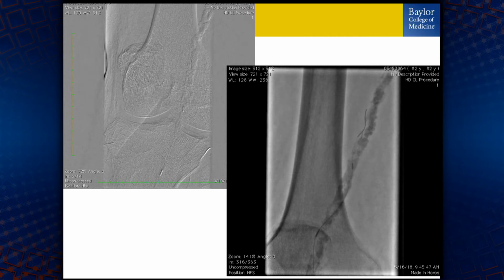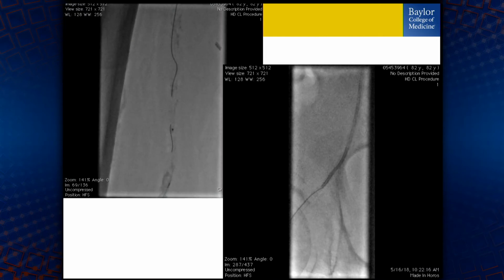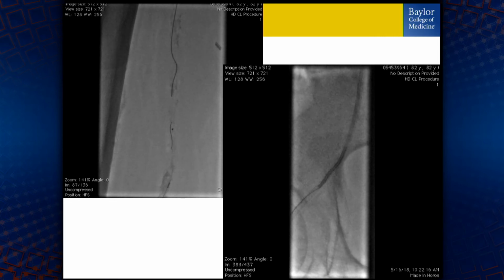You could see the angiography through the microcatheter. Again, that's at CXI, and that is a wire working. What we're using there is a CTO wire. This is a very complex scenario given the fact that the calcification really becomes a burden to your wire crossing. Ultimately, all of these reverse CARTs and whatever you need to do end up with what you see here. Wire passage from below into the luminal segment, and then rewiring of that segment from the crossover and/or from the antegrade segment. In this case, because of all the diffuse common femoral disease, I did go up and over.